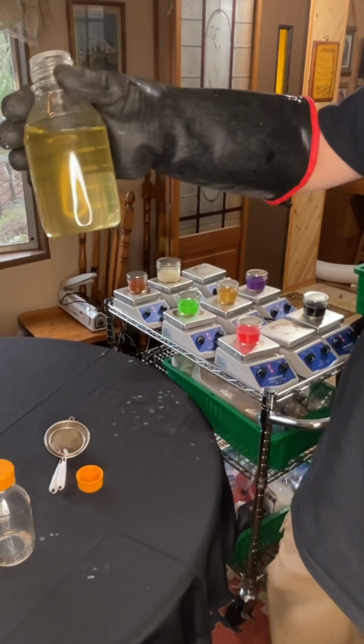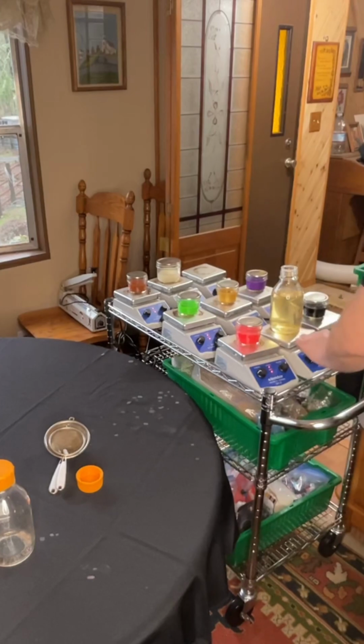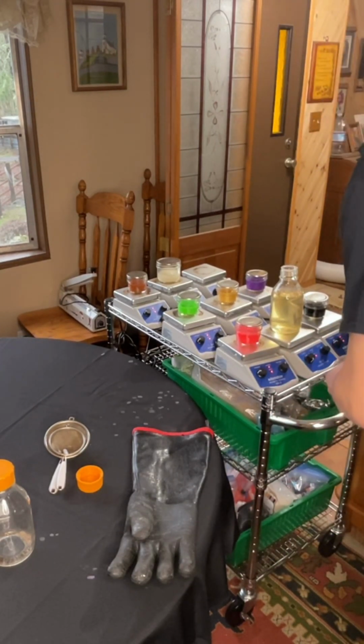So now we have a much clearer Gellan gum here. We're going to throw it back on the stirrer just to keep it hot and going while we're doing the rest of our project here. We'll put a fresh magnet in there and get it going.